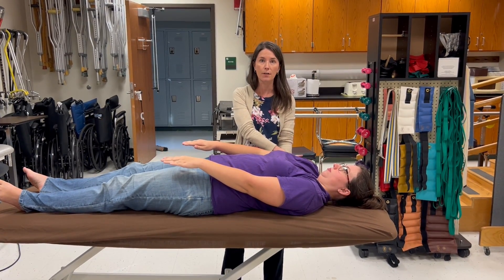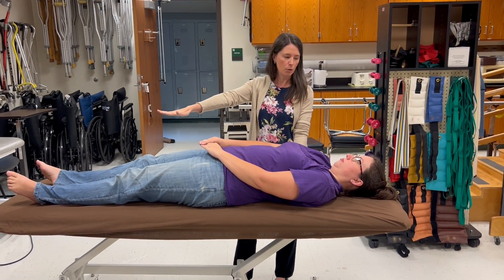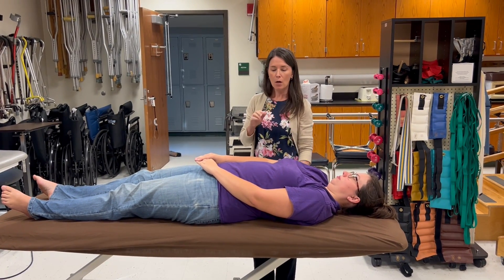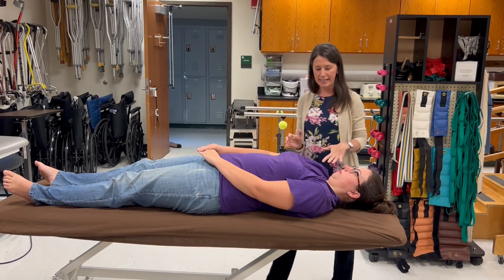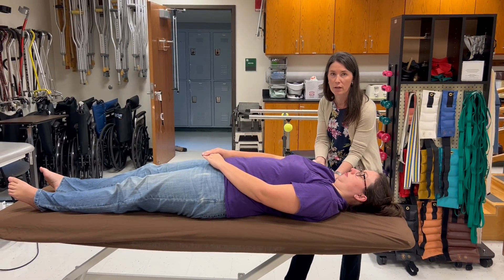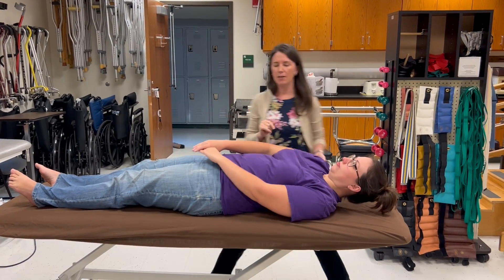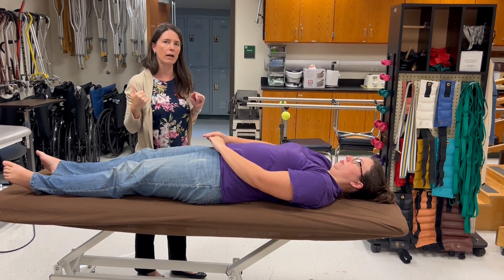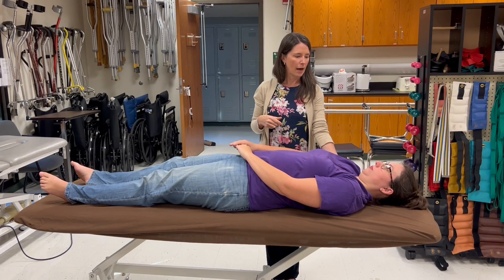The only compensation to check for is to make sure the feet are not coming off the bed. When testing left trunk rotation MMT, I tend to stand near the right side of her head so I can see two things at once: I can make sure the right inferior angle clears, and I can also check her feet. If I'm standing down at the feet I can neither see her feet behind me nor see the inferior angle because it's underneath her. So that was a grade three.